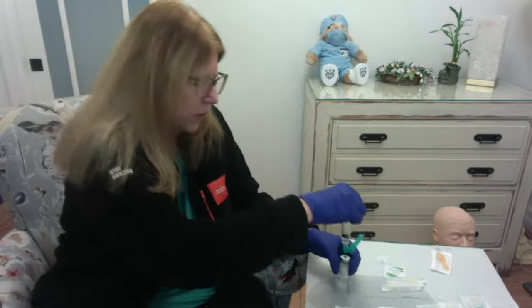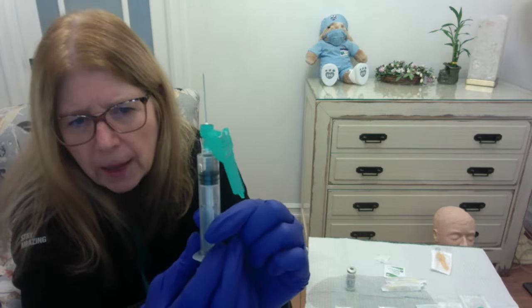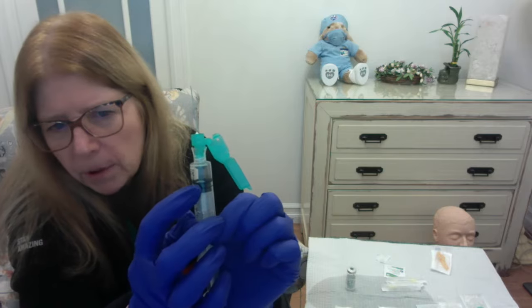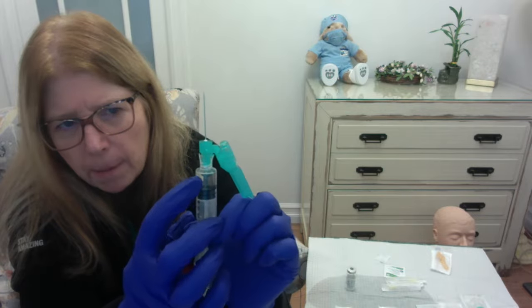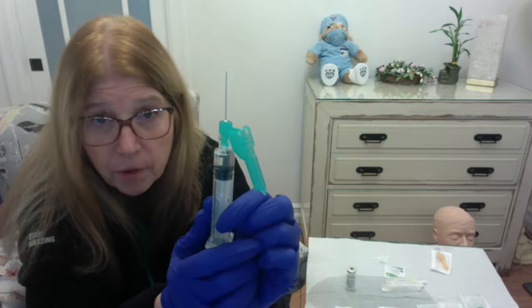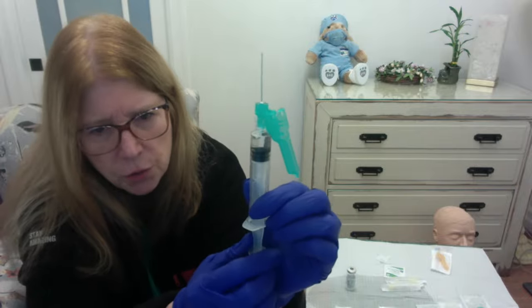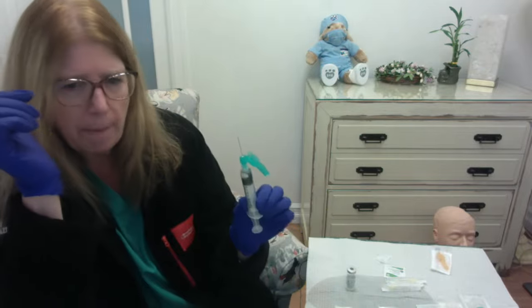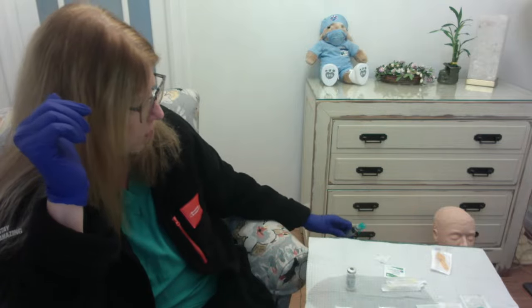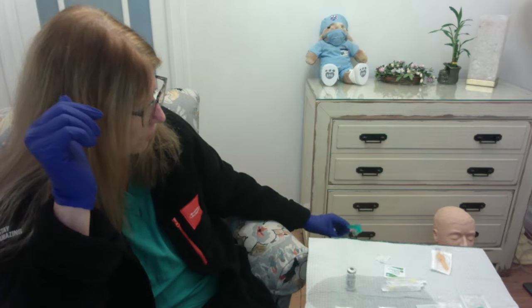Okay? So let's invert this and take this needle out. So I want you to have a look here, and I'm hoping that you can see that bubble that just moved, right? You can see a little bubble down here, and then you can see a bubble up at the top. Every place that you have air is a place that is taking up the space where medicine should be. So this would be underdosing the patient. So here's what I want you to do first, okay? I want you to tap this syringe on the end of the table. And you want to try to move that air bubble that's at the bottom and move it up to the top.